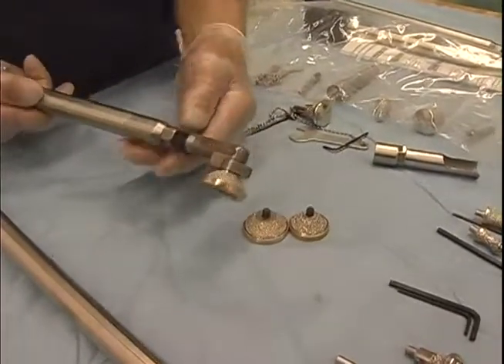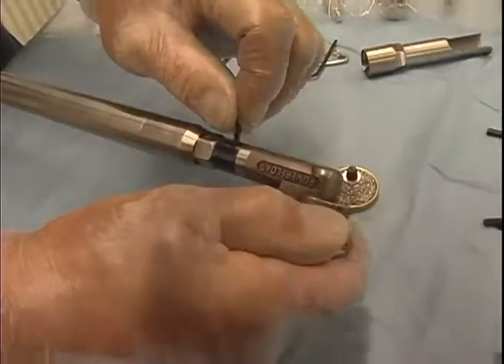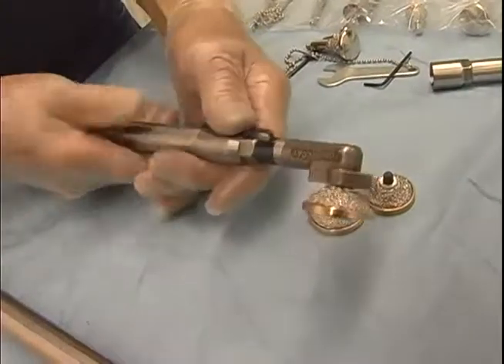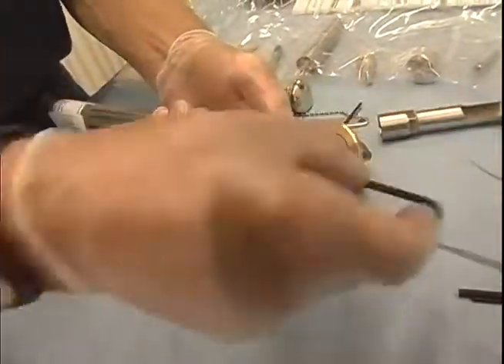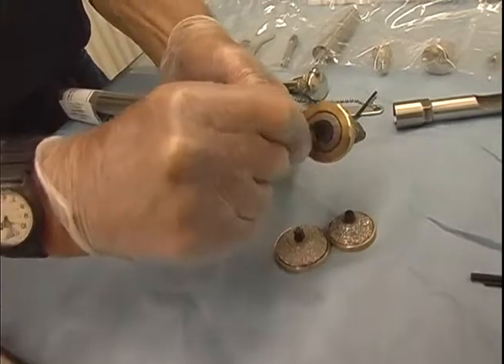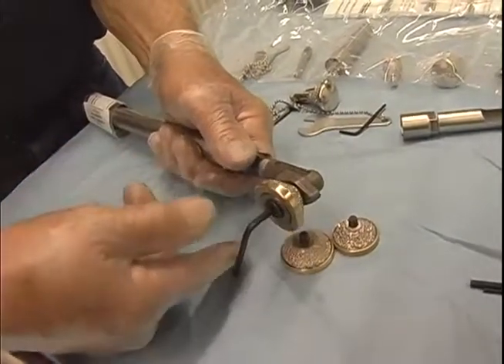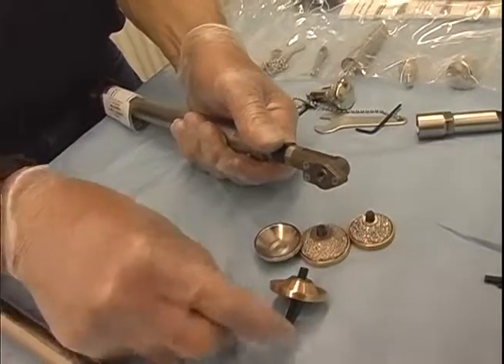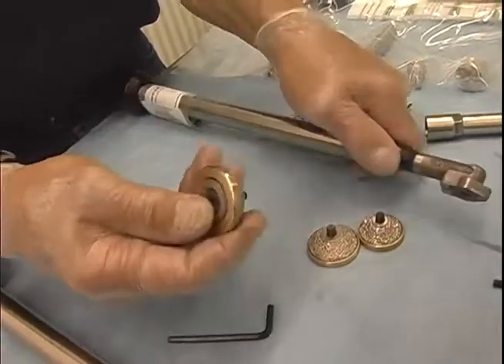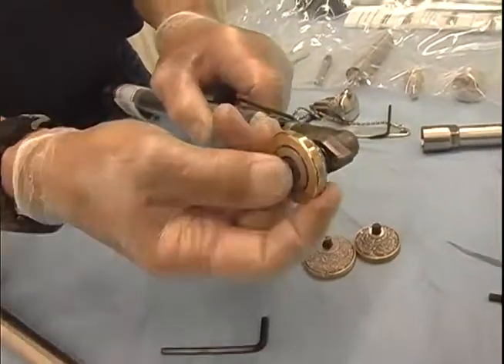It is removed by locking the shaft. You turn the wheel until the shaft lines up with this hole, and then it slips into the hole. That locks the shaft. So now we are able to undo the chamfer burr by putting in this Allen wrench and simply unscrew the burr. The guard sits over top of the grinding surface and is held in there with this screw, which screws into this unguarded right angle.